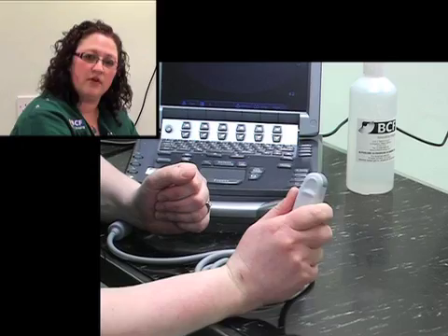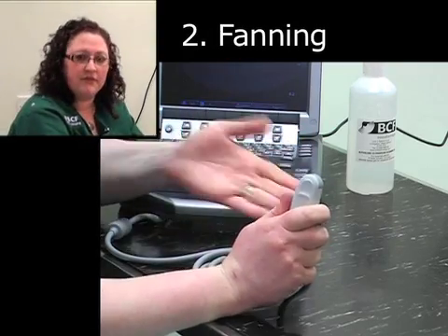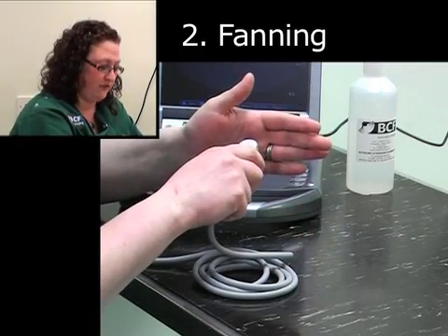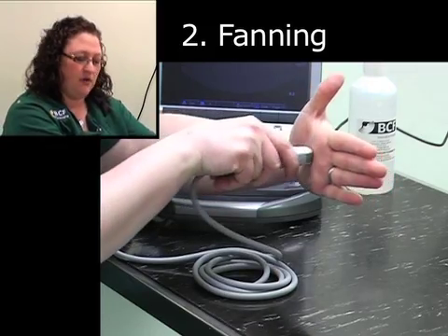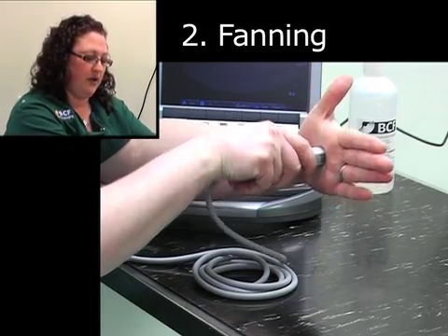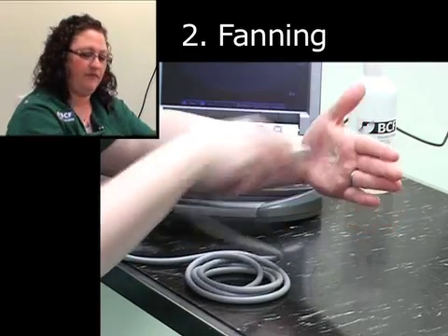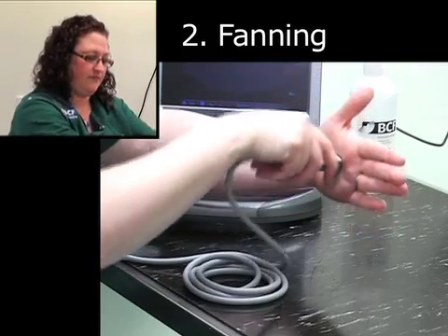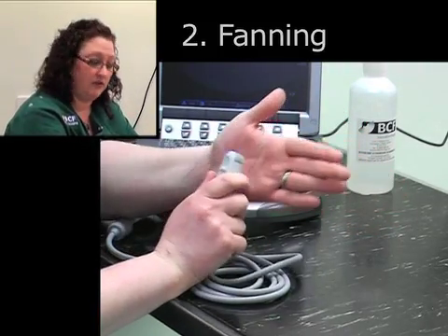The second movement that we can do is called fanning. And this is in a 90 degree angle to the rocking motion which we just described. In fanning, the motion that you use is the probe on the patient, and you fan up, and you fan down. And you'll notice that the probe doesn't actually move along the patient at all.